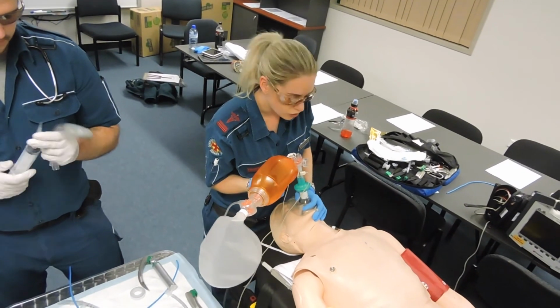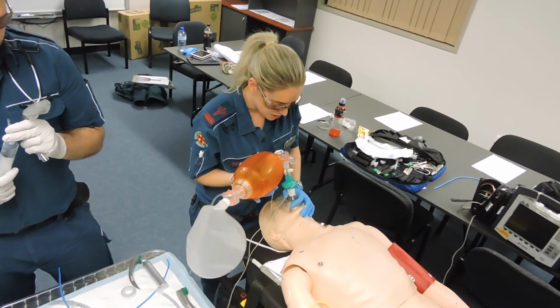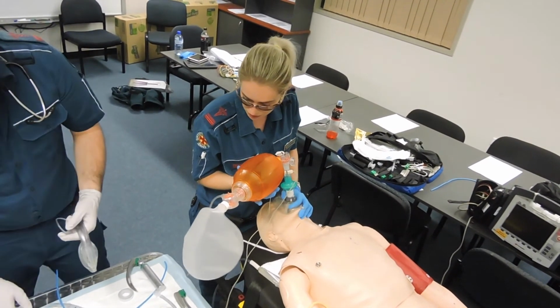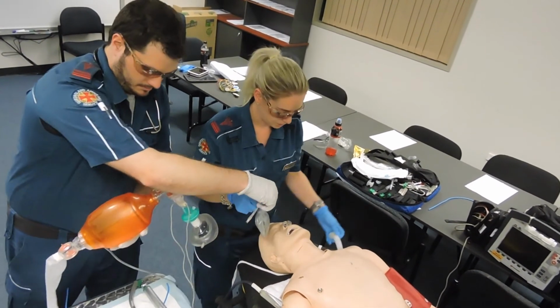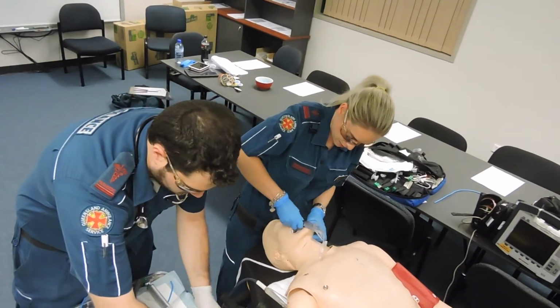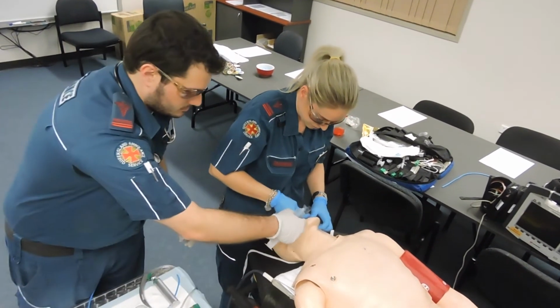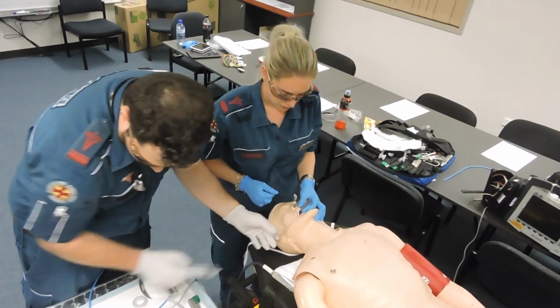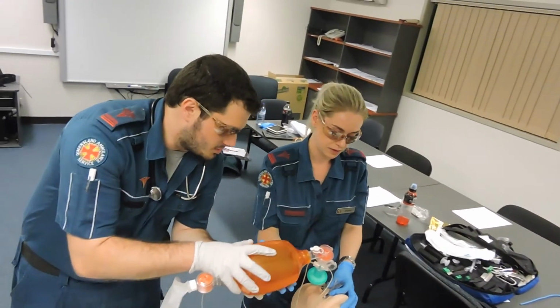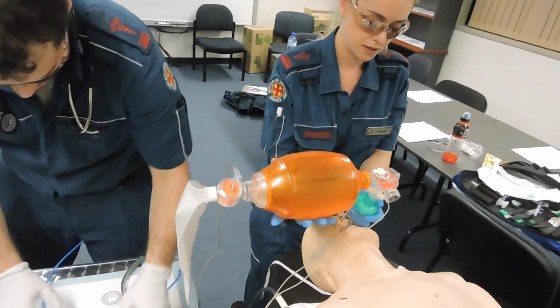This is a very important task. We don't want to spend too much time on this. LMA prepped. Following the hard palate. End-tidal CO2, bag valve mask. Perfect.